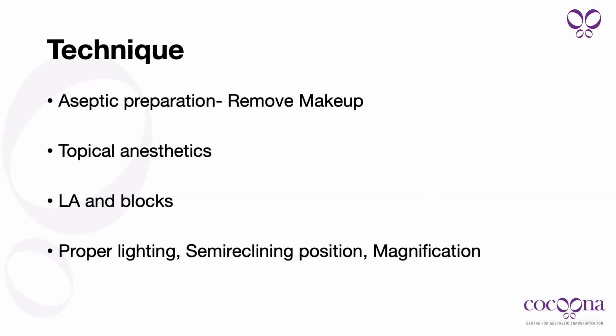So just a few basic tips on using fillers. Of course, it is very important to have aseptic preparation, particularly remove the makeup entirely because this could be a risk of contamination of the filler area. Use topical anesthetics. You could use local anesthesia and blocks. Proper lighting is important. Inject in a semi-reclining position so the blood vessels are less distended or engorged, and use magnification.